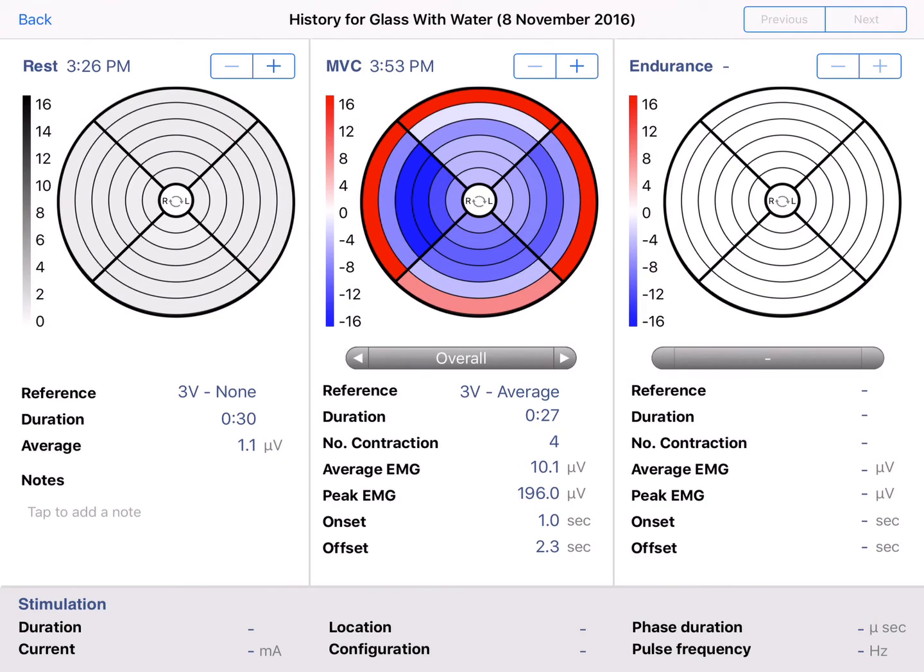You can view the saved rest measurements by using the plus button. You can view the saved MVC measurements by using the plus button as well. Now you can also flip through the different contractions. Thank you.